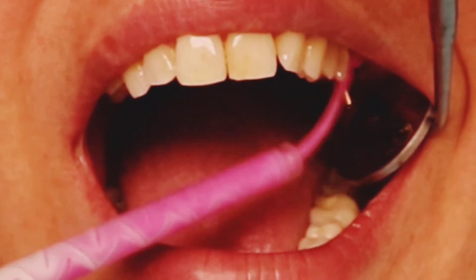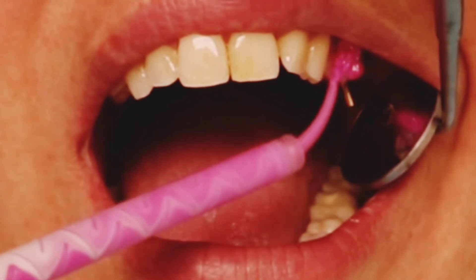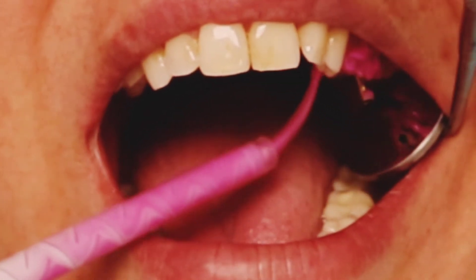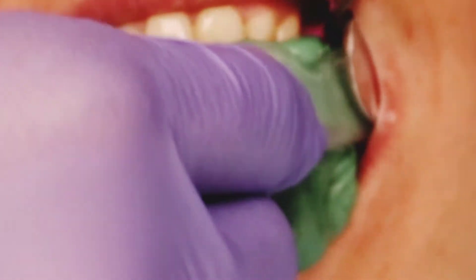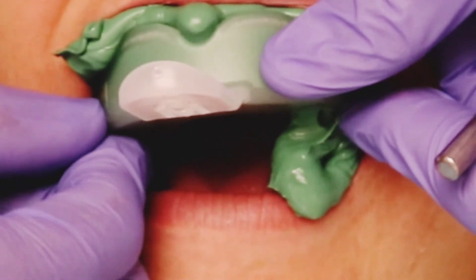Here you can see I'm adding the light body all around the periphery of the impression coping. I'm adding it to the buccal surfaces, the interproximal surfaces — mesial and distal to the impression coping — just adding it all around. It's good to have a good amount; I add a little extra just to be sure and to get a good impression.